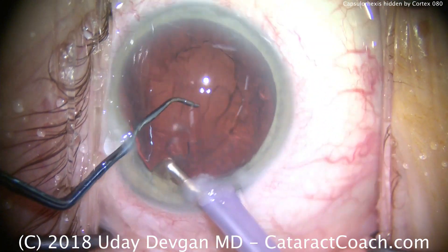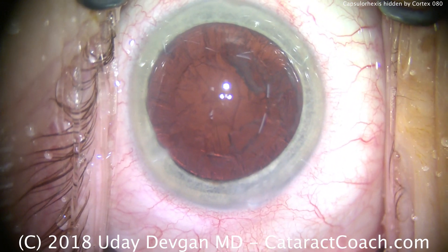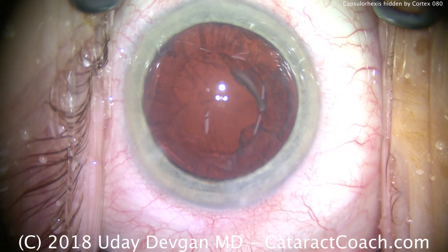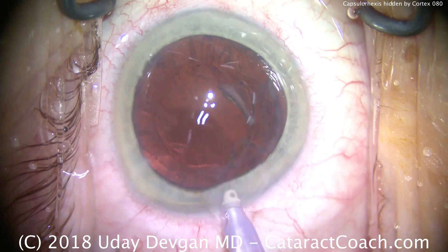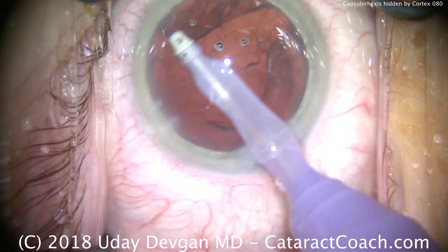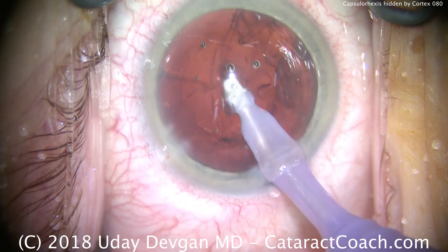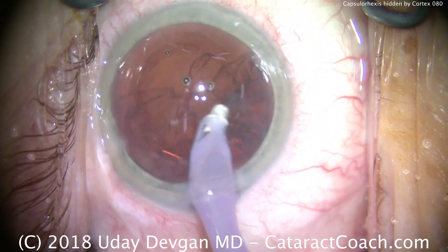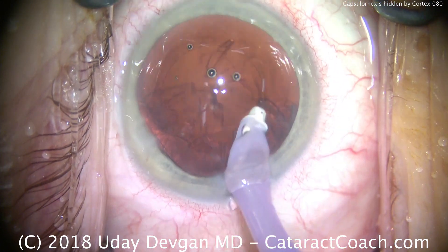Last little nuclear pieces coming out — there's the last one, and we're ready for irrigation and aspiration. We do have a nice round capsulorhexis, and that'll be about five millimeters in diameter. The capsulorhexis forceps were used to measure the capsulotomy diameter: those forceps have a mark two and a half millimeters from the tip, which corresponds to the radius, and a second mark five millimeters from the tip, corresponding to the appropriate diameter of our capsulorhexis.